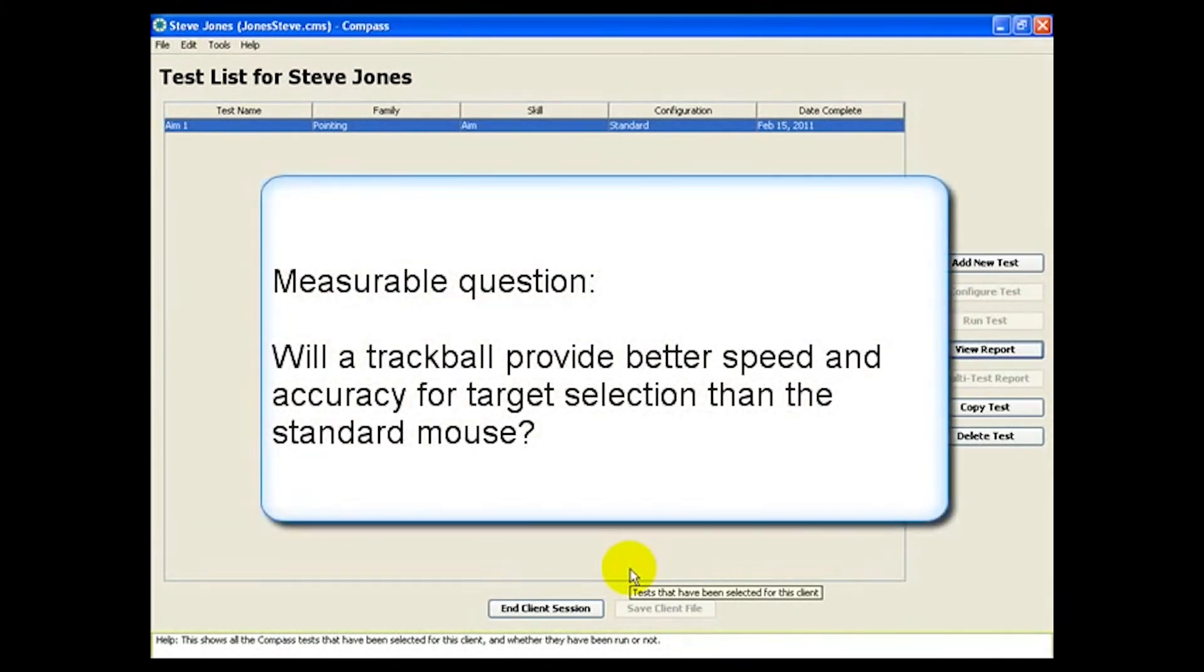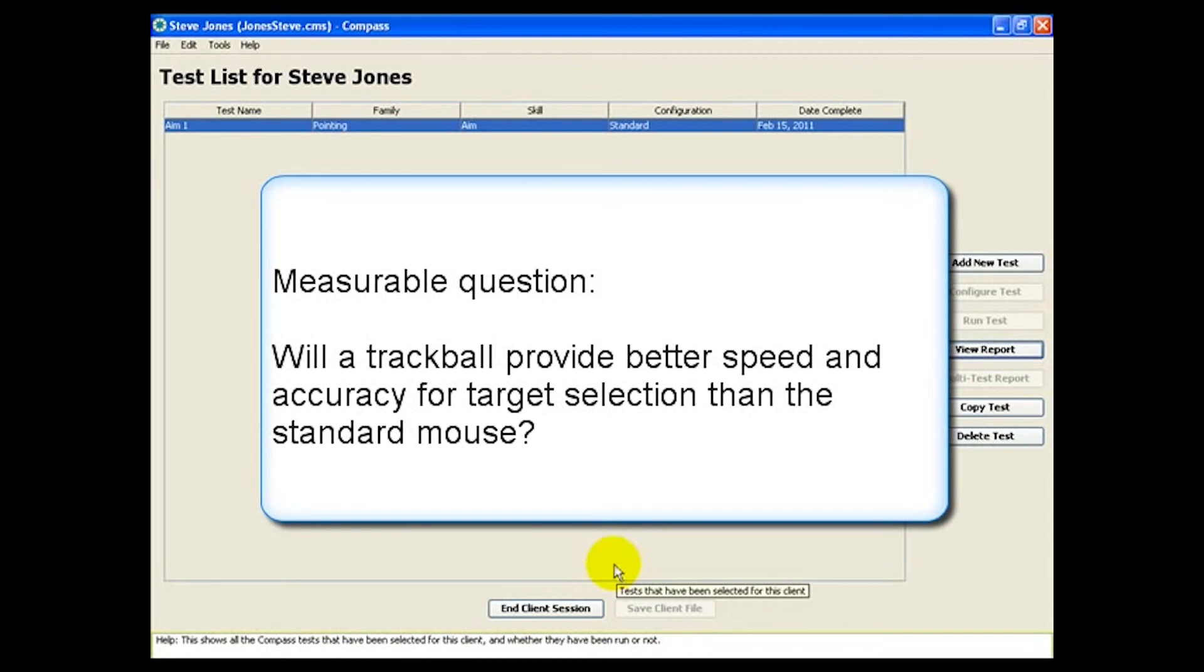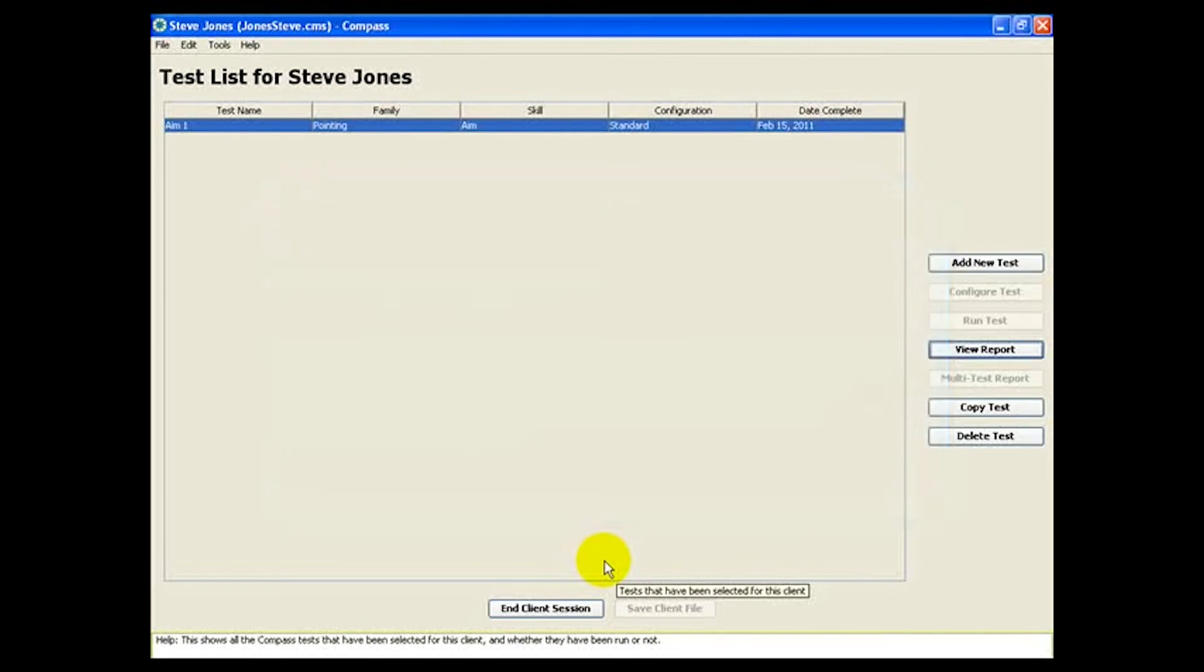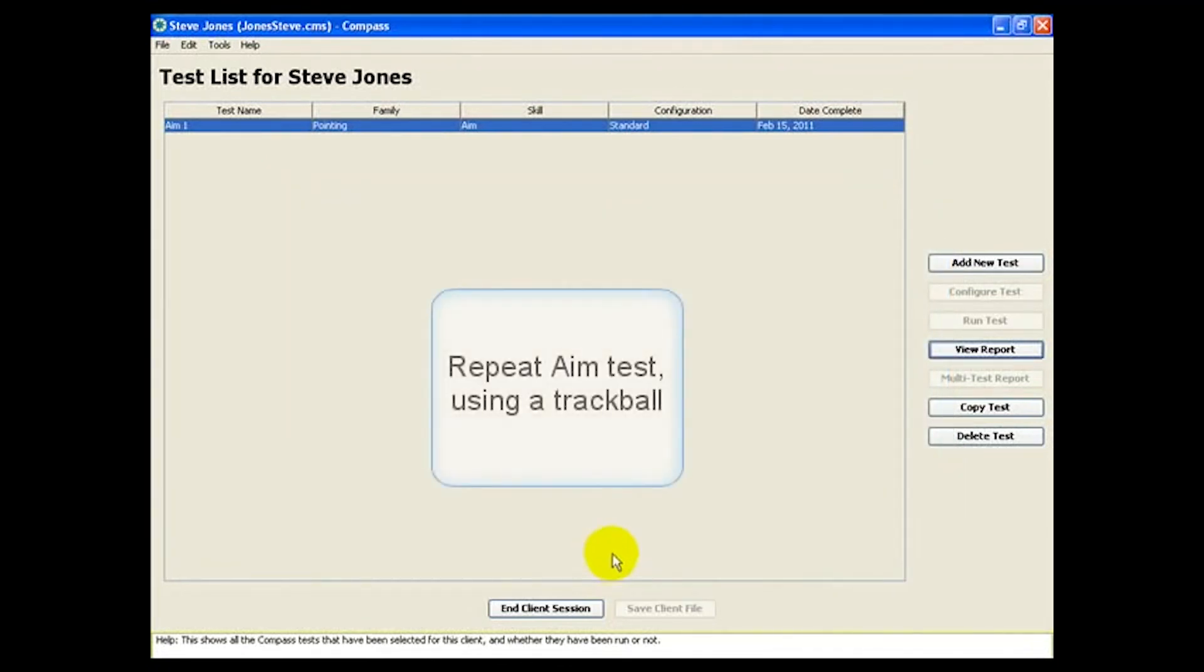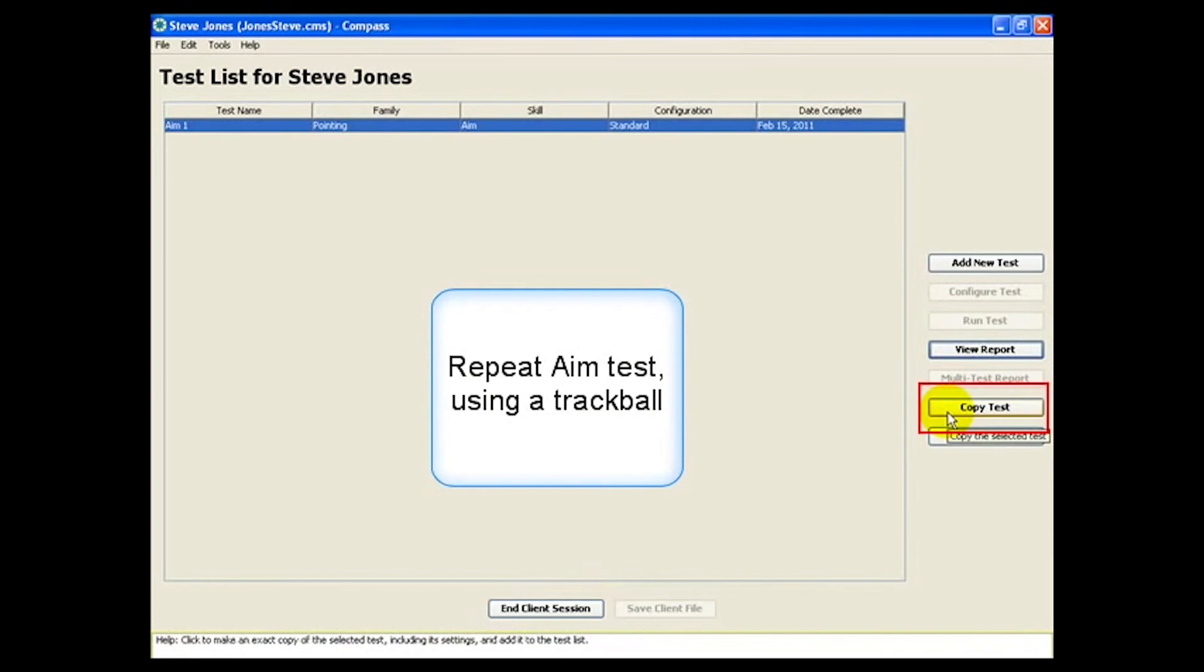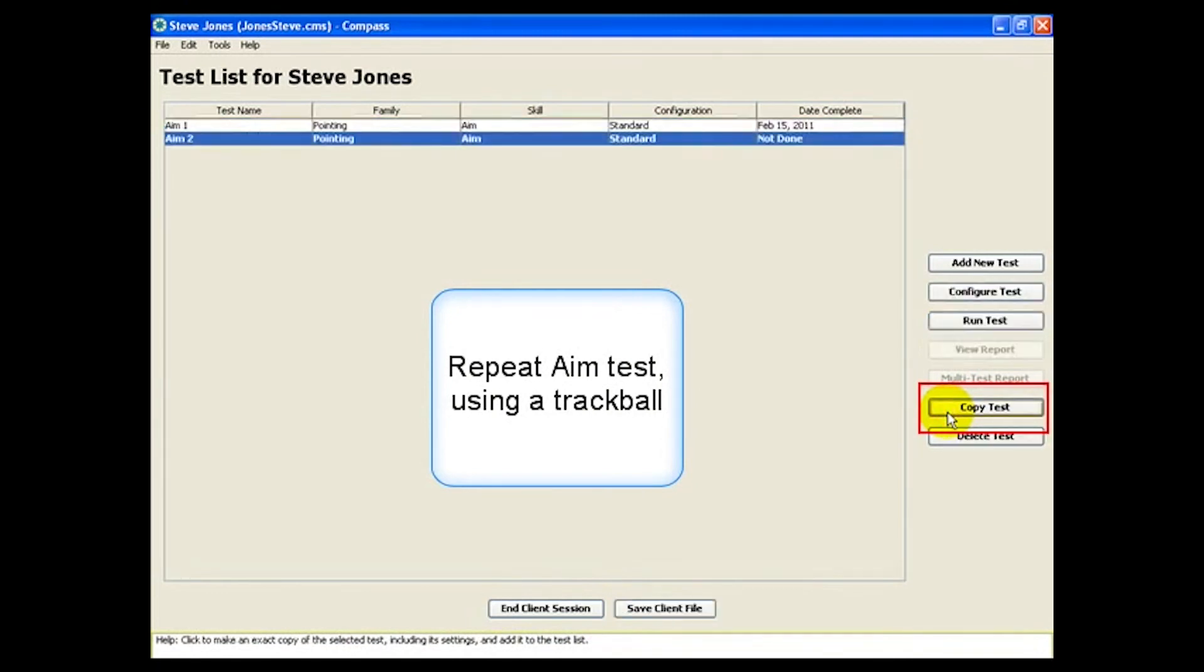So our measurable question becomes more defined. Will a trackball provide better speed and accuracy for target selection than the standard mouse? To answer this question, we'll repeat the AIM test, but ask Steve to use a trackball this time.